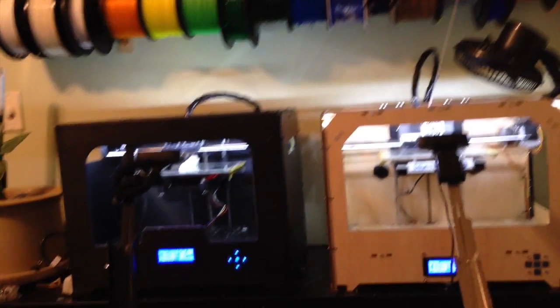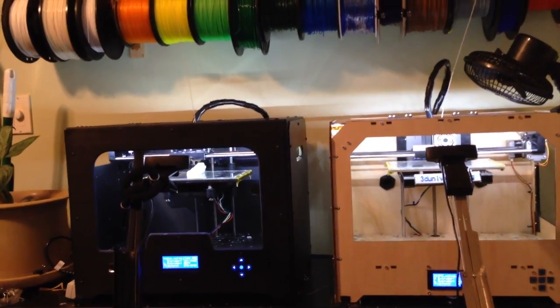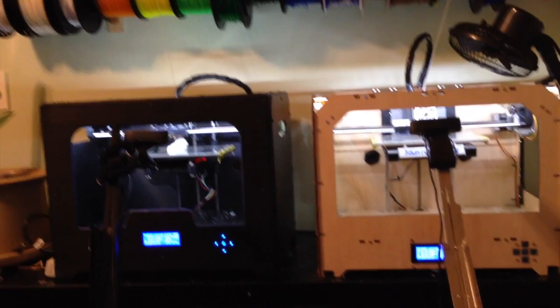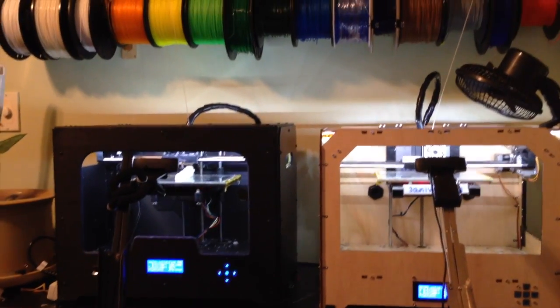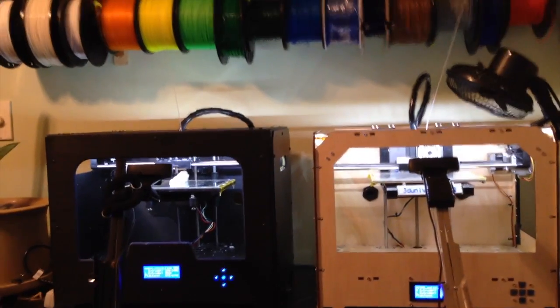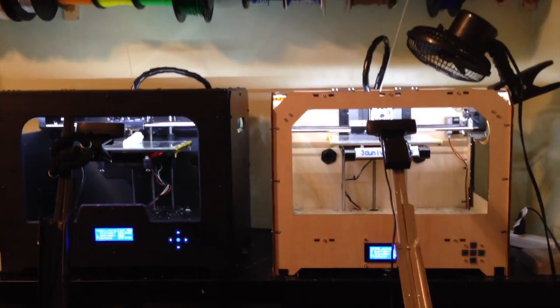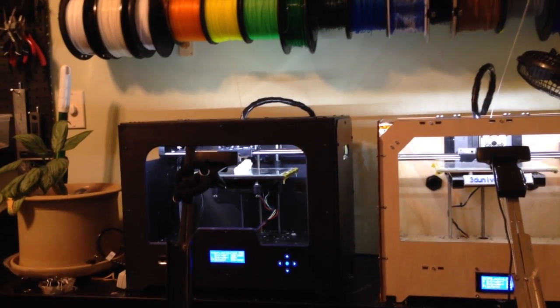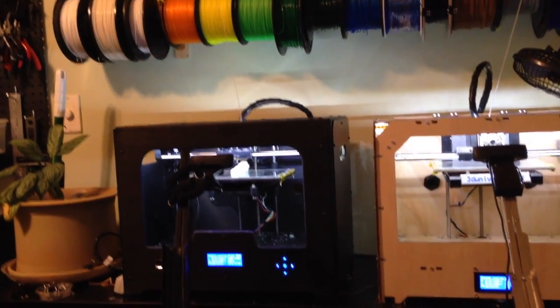The idea here is to try to come up with a finger design that has integrated flexible living hinges, such that you can print the whole finger in place and the flexible portions for the joints are built right into the print. In this case we're using a nylon based material — this Bridge Nylon, Taulman Bridge Nylon on the left there on the Creator X.